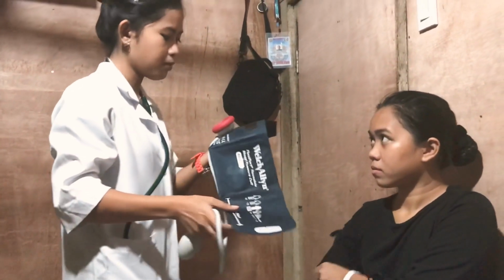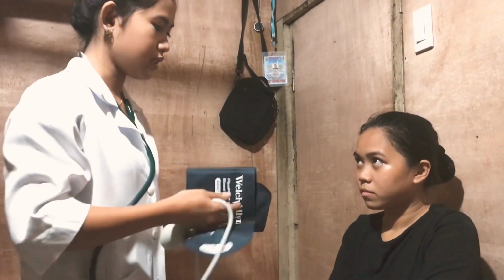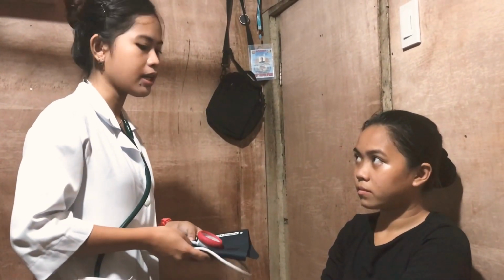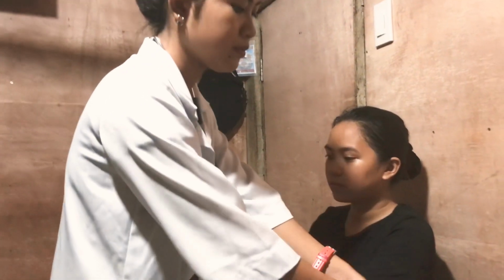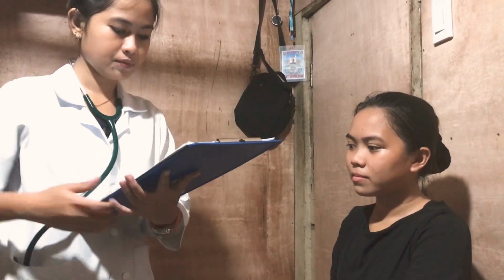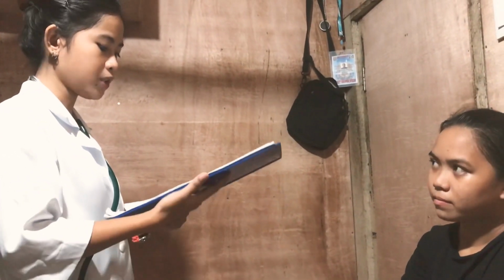Your blood pressure, ma'am, is 90/60. Ma'am, your blood pressure is 90/70. And I will record your blood pressure, ma'am. All in all, ma'am, your vital signs are normal. And I will repeat it again.